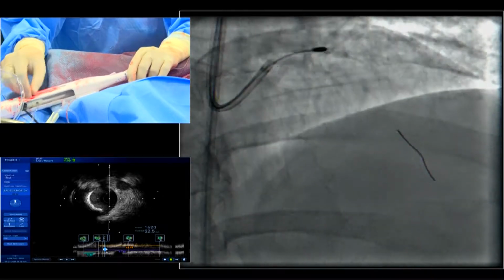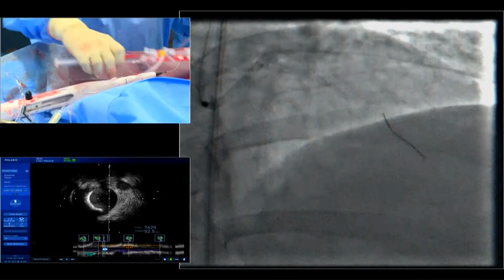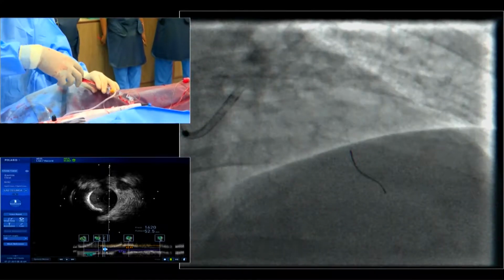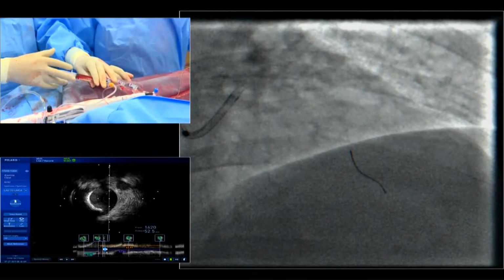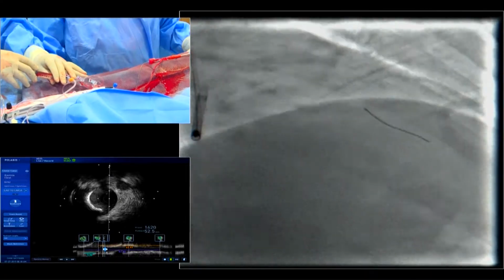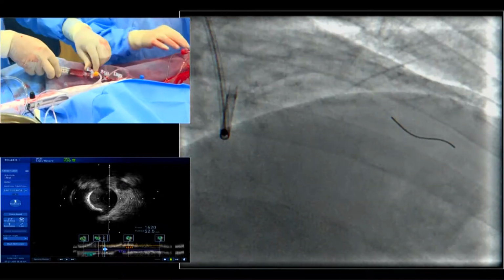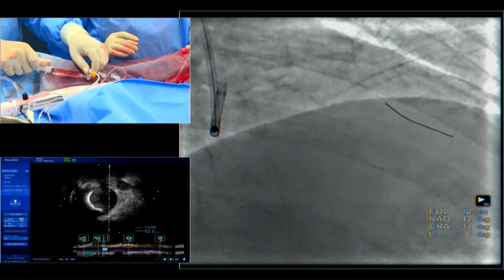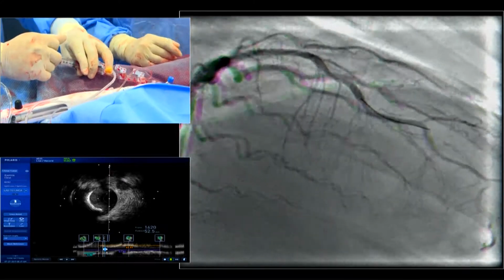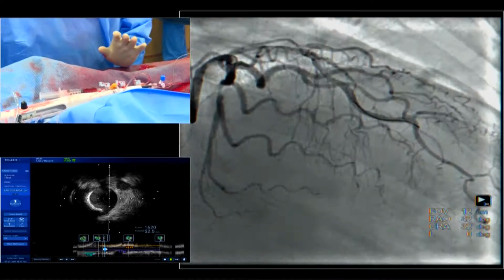I think we'll go up to this. Okay. We have just ablated the tightest portion of the ostium. Now we'll just take a picture. Take a picture. Yes. Okay, take a picture. Ready? Yes. Perfect. Come on, so our job is done. We just ablated the ostium.